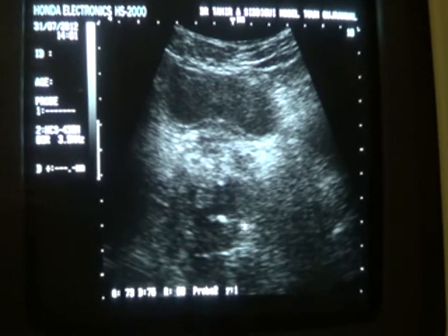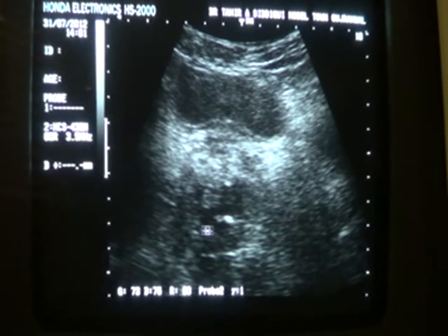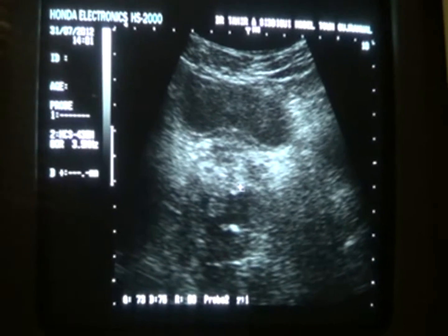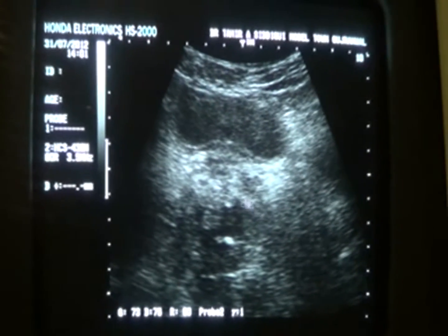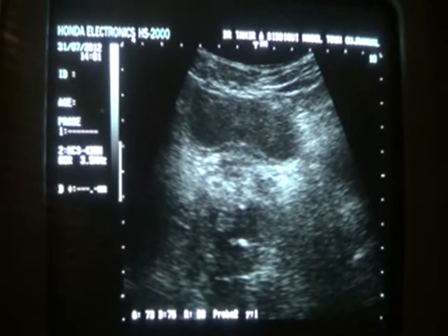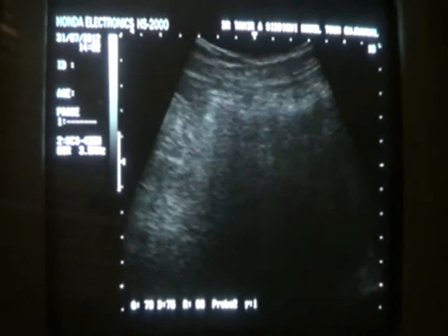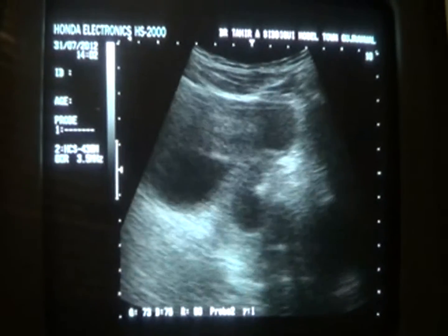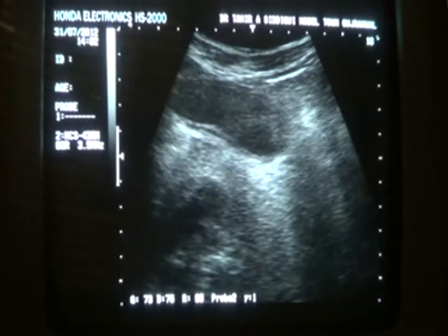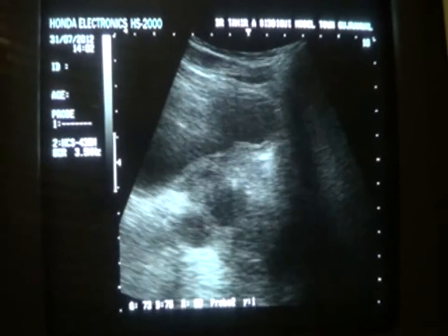It has internal echoes, dependent region debris, these fine sand-like particles, as well as internal calcification. This is a small calcification and marginal calcification. This is the outer surface of this focal lesion. This is the echogenicity. This is marginal. This is internal. Seeing it in transverse section, and now in longitudinal section.